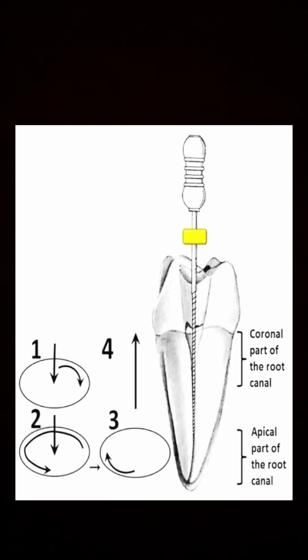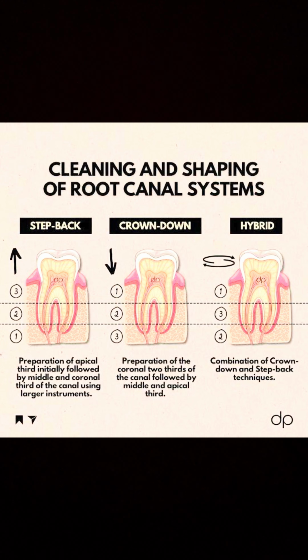After complete removal of the roof of the pulp chamber, the coronal pulp is removed with a sharp endodontic spoon excavator. The chamber is irrigated with 5.25% solution of sodium hypochlorite and is dried with suction. Next, the canal orifices are located by probing with an endodontic explorer along the anatomical grooves located in the chamber floor leading to the root canals. These anatomical grooves are sometimes called the dentinal map.